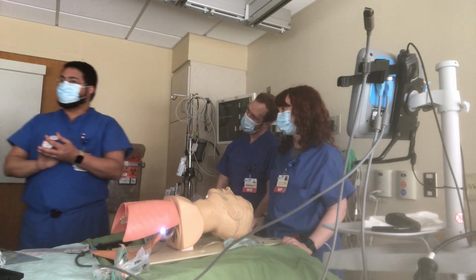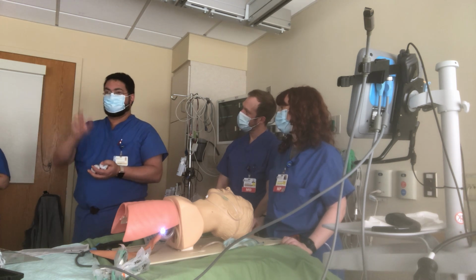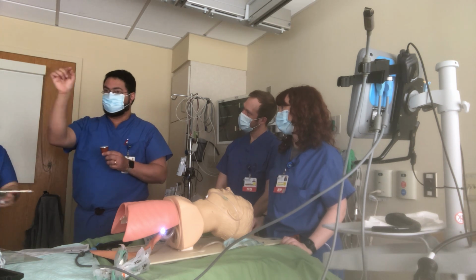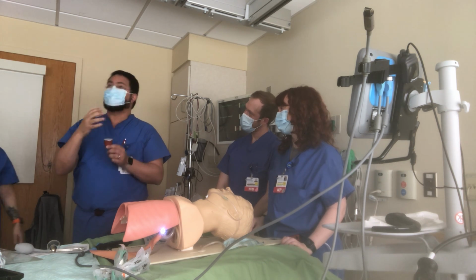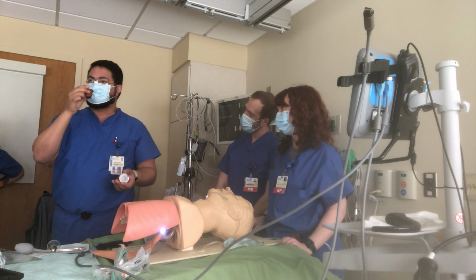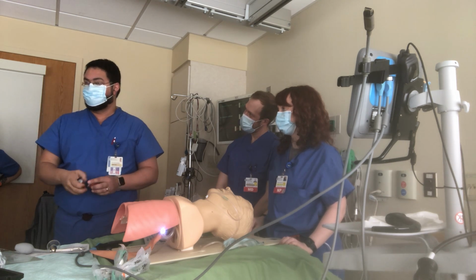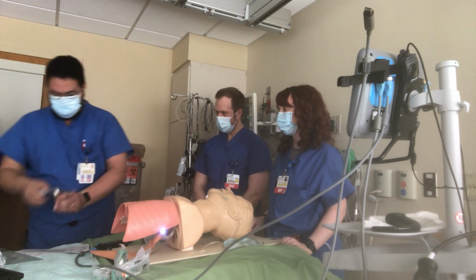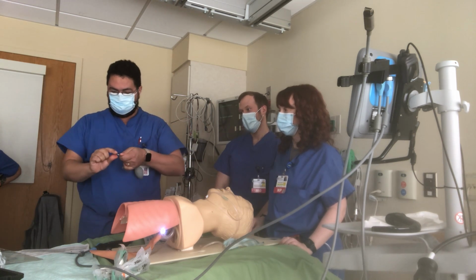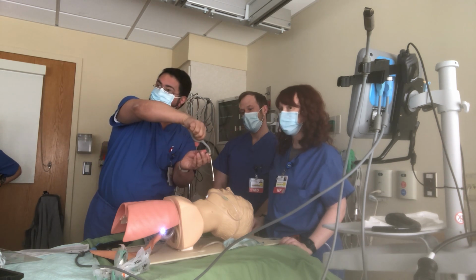I use that at the end, because sometimes they can't swallow it themselves. So it could be an emergency when you give this. Be careful when you give this, because sometimes they choke on it. So last thing before I intubate, I give him this viscous lidocaine: keep it in your mouth as much as you can, gurgle it, and then swallow it. This one here goes like this, but if you remove this, you can turn it down like this, see? And I can go all the way back and push at the larynx.